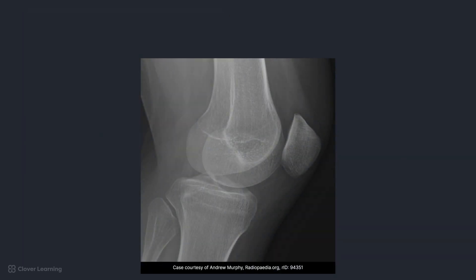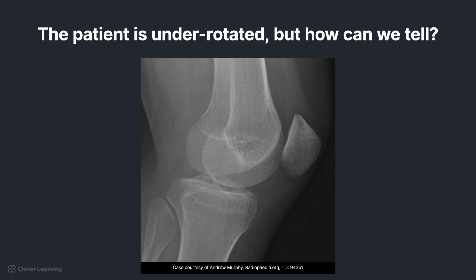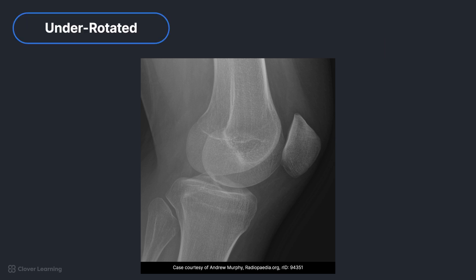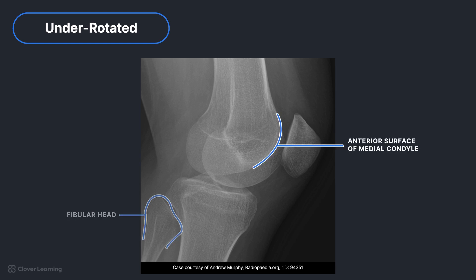Before we move to the patella, we should discuss how to recognize under and over rotation in a lateral knee, because this is a common error and it can be difficult to determine how to correct the problem. In the first image, the patient is under-rotated. The key anatomy to locate to determine the superimposition error is the anterior surface of the medial condyle and the placement of the head of the fibula. If the anterior surface of the medial condyle is farther from the patella and the fibular head has minimal or no superimposition by the tibia, the knee is too far from the image receptor and must be rotated externally more.